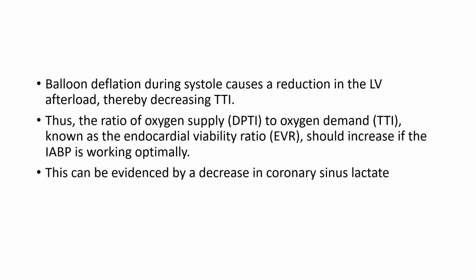Balloon deflation during systole causes reduction in the LV afterload and decreases this tension time index. Thus, the ratio of oxygen supply to oxygen demand, known as the endocardial viability ratio, should increase if the IABP is working optimally. This can be evidenced by a decrease in the coronary sinus lactate.